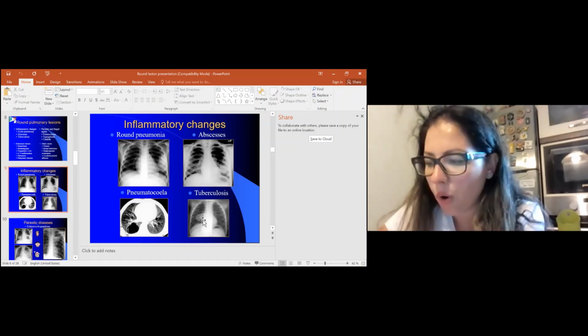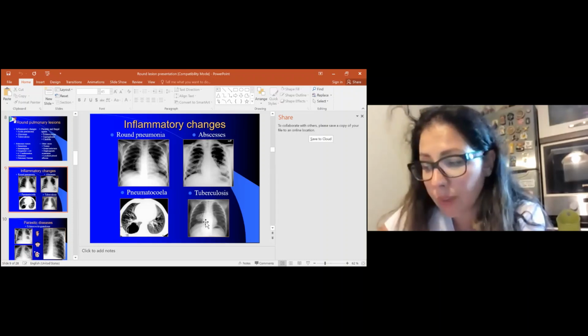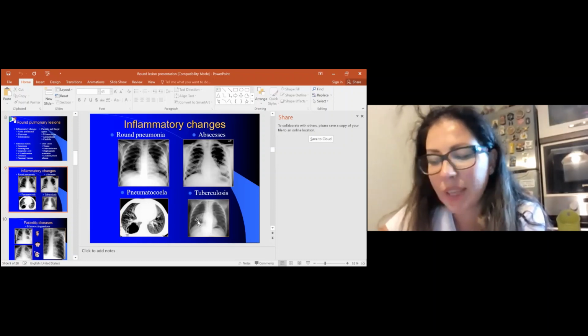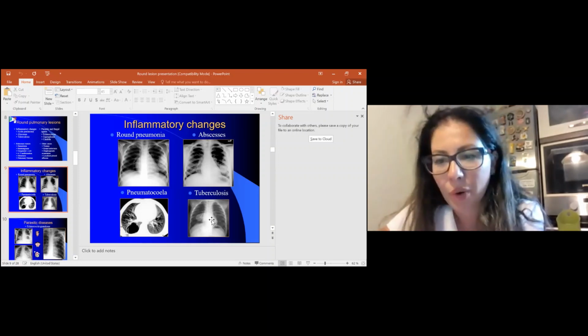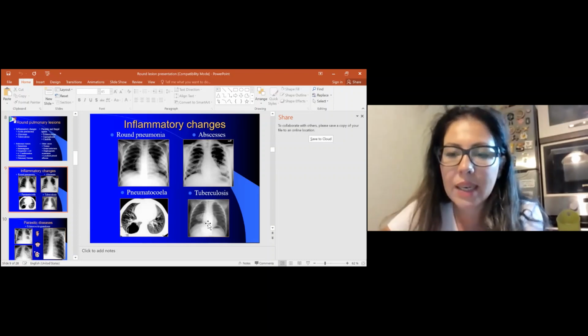Initial pulmonary focus may present as a round lesion with different dimensions, and the hilar glands are enlarged. It can also help with differential diagnosis. Cavitation in the primary focus in children is rare. The picture of tuberculosis in children and in adults is very different.